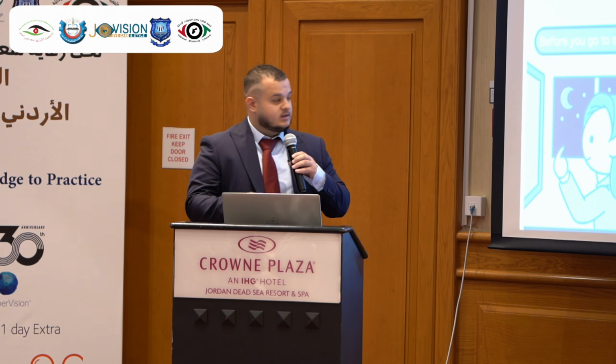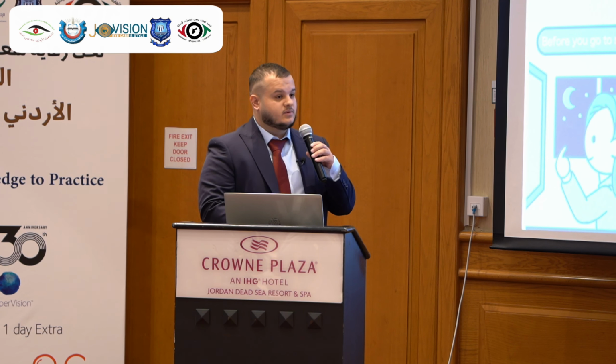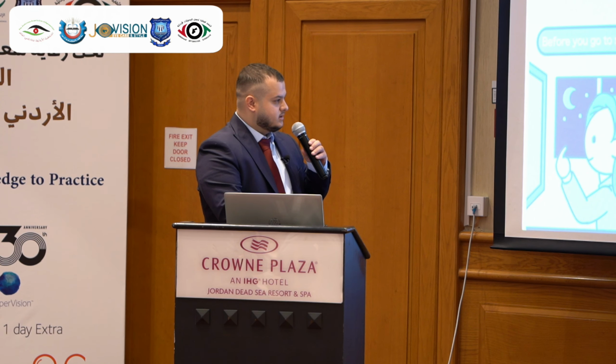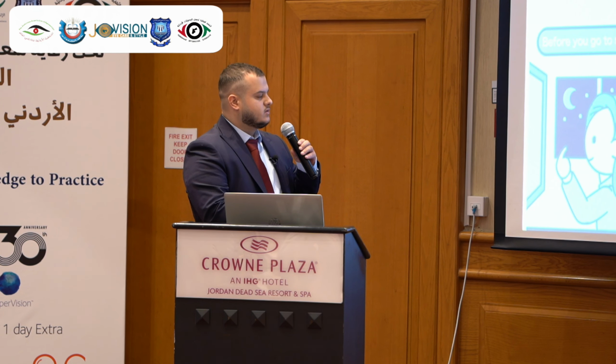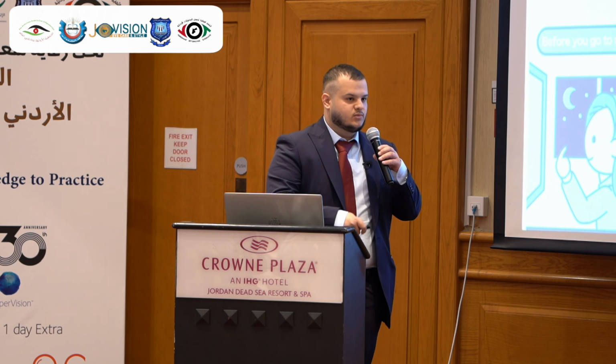In the morning, the patient removes the lens and continues his day with clear vision without any need for glasses or contact lenses. As we see here, the original corneal surface without Ortho-K lenses, and here with Ortho-K at daytime after removing the lens.